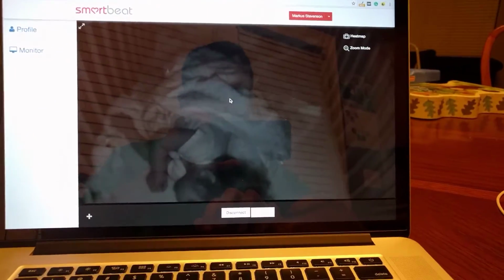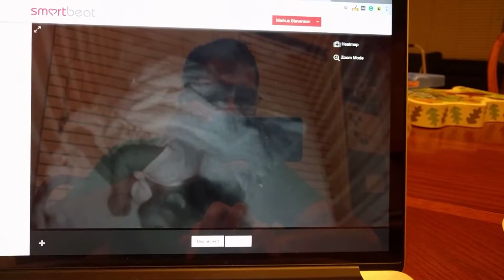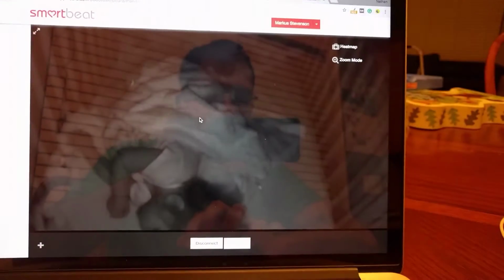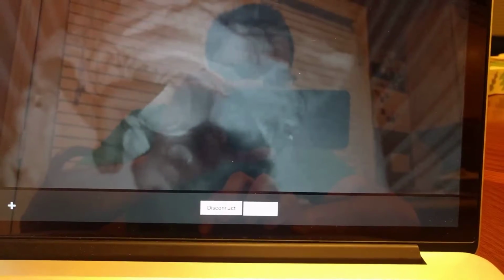Okay, so notice how fast that connected. That's because, and here I'll hit the disconnect button so you can see it again. That's because we're not actually using an internet connection. We're connecting directly with the device because it acts as its own server. So welcome IoT.